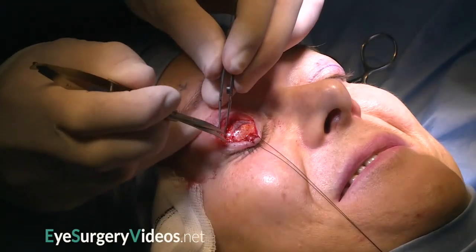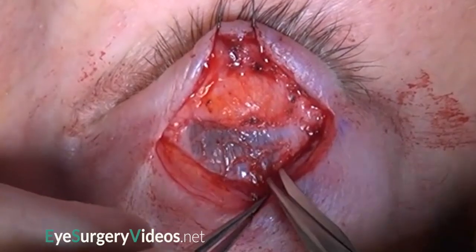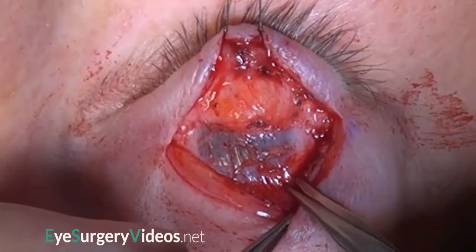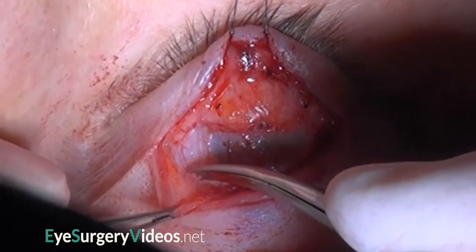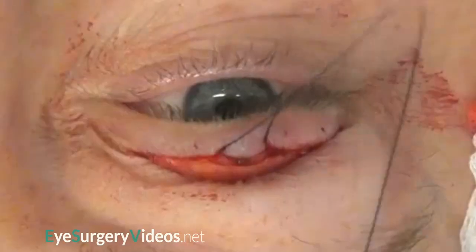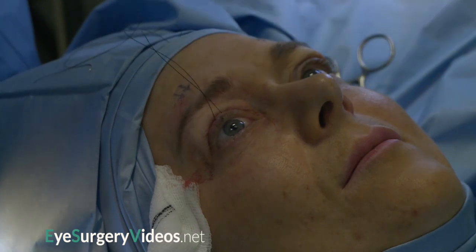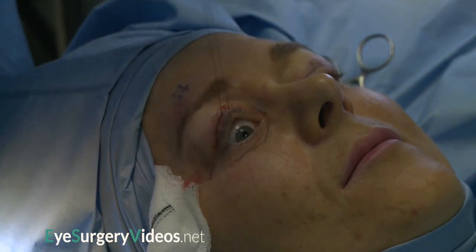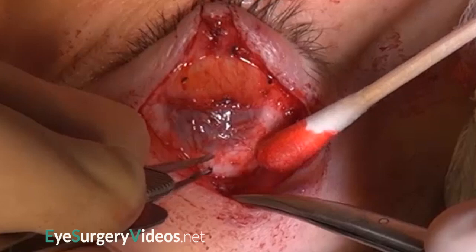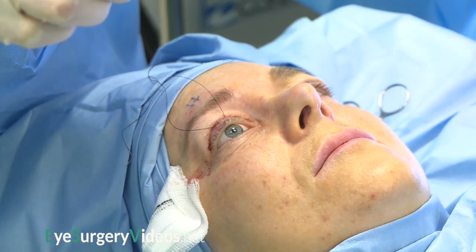To lower the lid further, the lateral and medial horns are transected, and Muller's muscle is dissected from conjunctiva further superiorly. One pitfall of upper lid lowering is the tendency to flatten the lid profile. This can be avoided by ensuring that the medial and lateral portions of Muller's muscle have been adequately recessed.